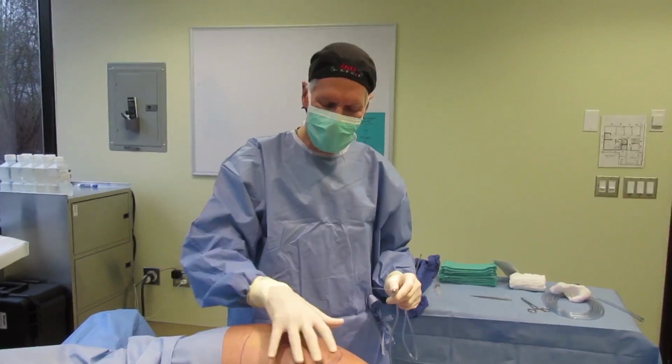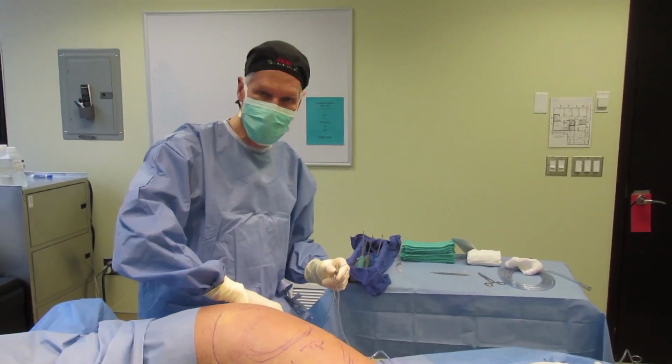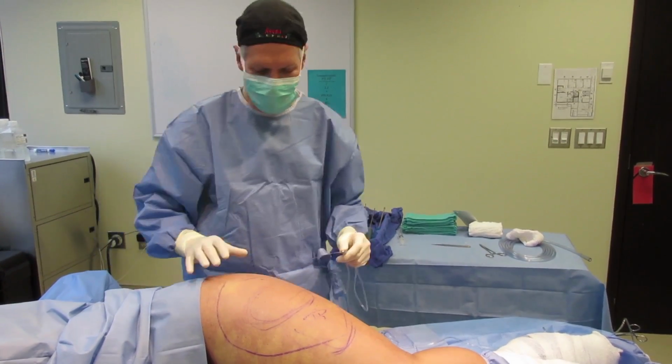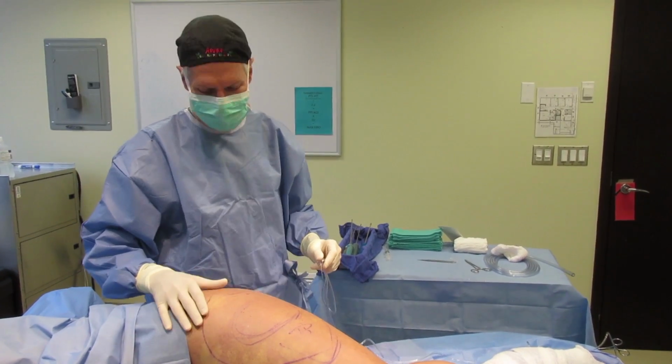We're going to be addressing her outer thighs, her inner thighs, her knees, and the so-called banana roll, which is in this back area, the upper part of the posterior thigh, below the gluteal crease. Very common combination to make for a slimming effect throughout the whole thigh.